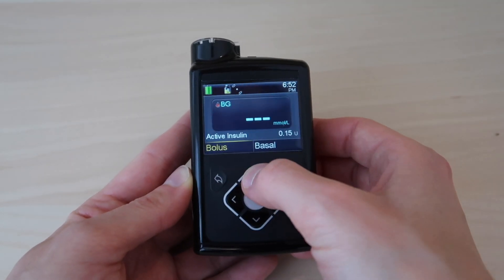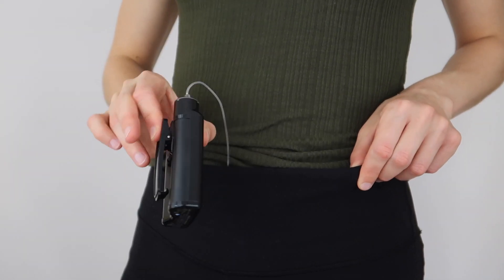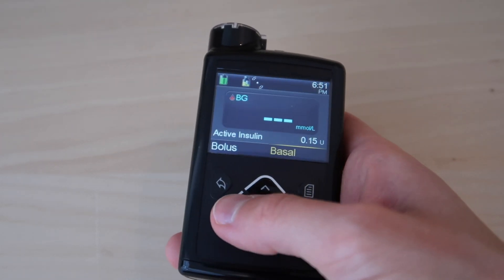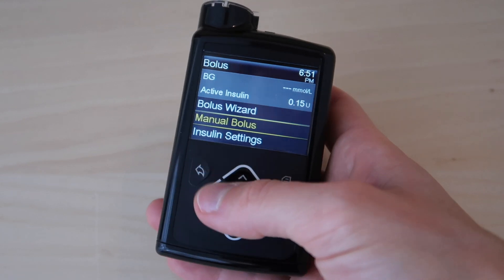There's really nice tactile feedback with the buttons — you get a click, a push in and a push out, so you know for sure you've pressed a button or haven't if you don't get that click. I love the belt clip — it's sturdy and clips onto trousers, a bra, wherever you want to store the pump. I also like that it can be used one-handed. Living in London, I'm often on the tube with bags, so being able to manage the pump one-handed is just great.